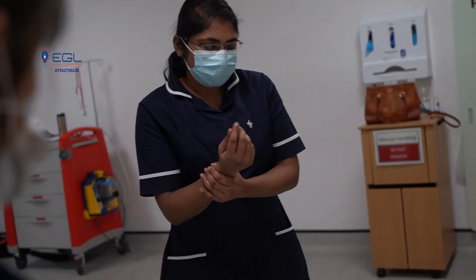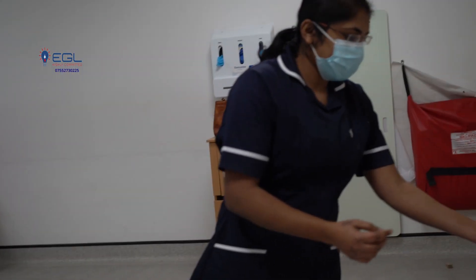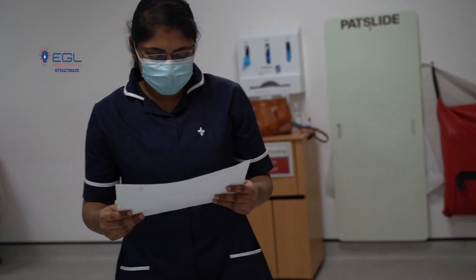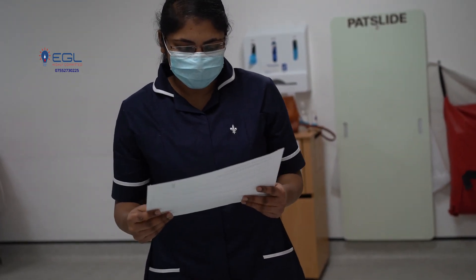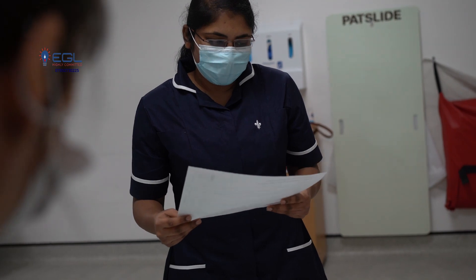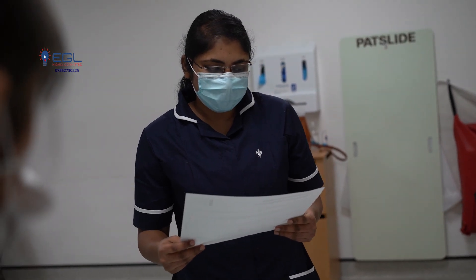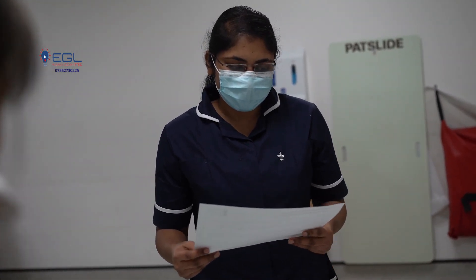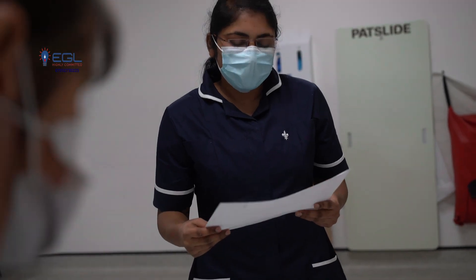Hi, good morning. Good morning. My name is Soni, I am your attending nurse today. How are you? I am okay. I am here to do a peak expiratory flow assessment. Is that okay? Yes, that's okay.